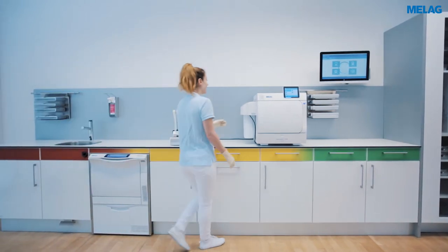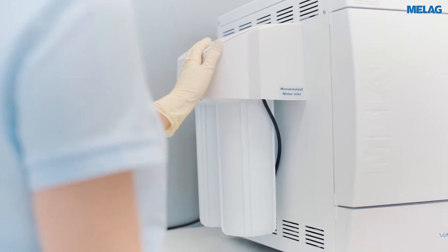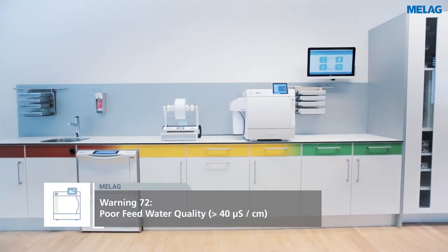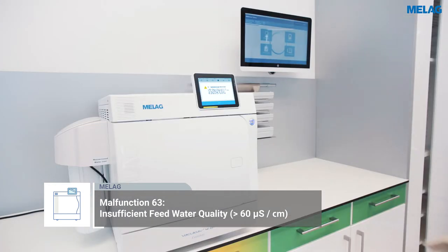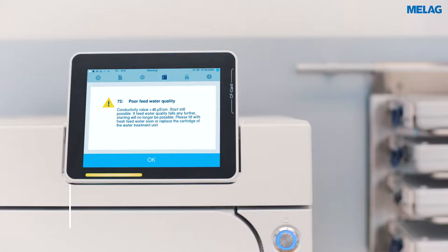The Meladem 40 Water Treatment Unit supplies the steam steriliser with demineralised water. The Evolution Series automatically tests the conductivity of the demineralised water during every sterilisation procedure and issues a warning if the water quality is too low.